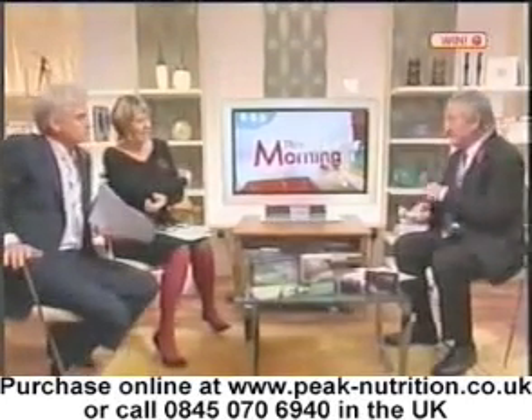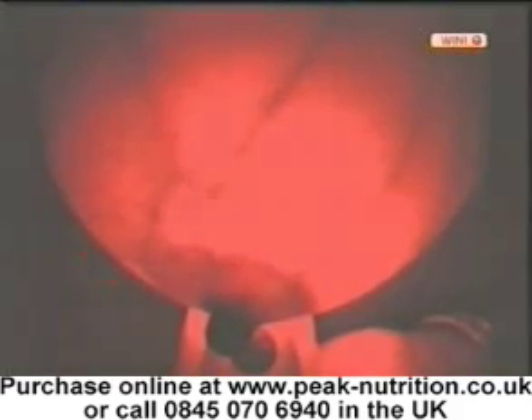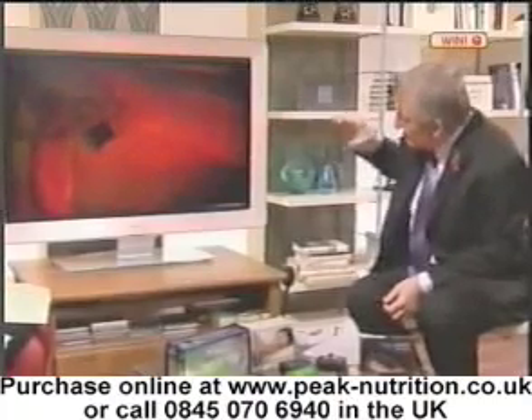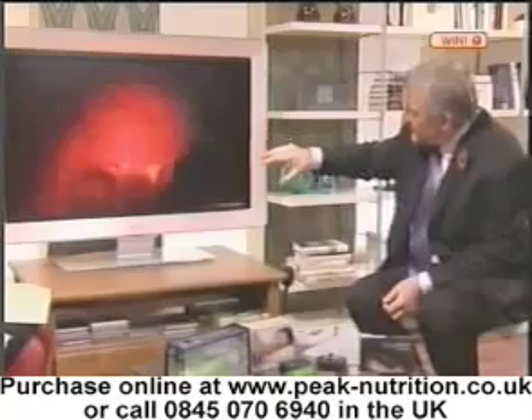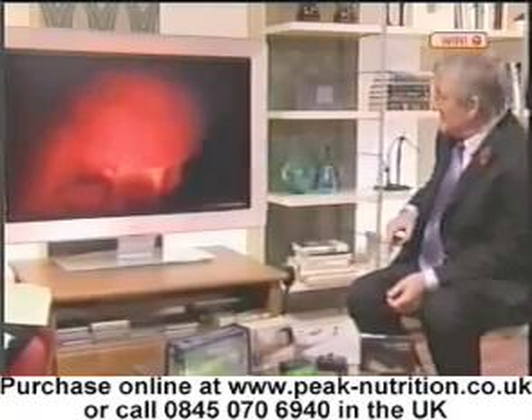We do actually have a couple of shots. There we are — she's pressing the torch against her breast tissue, and that is normal breast tissue. What you're seeing, the lines are veins and arteries, and that's looking down upon it. And again, a normal one.